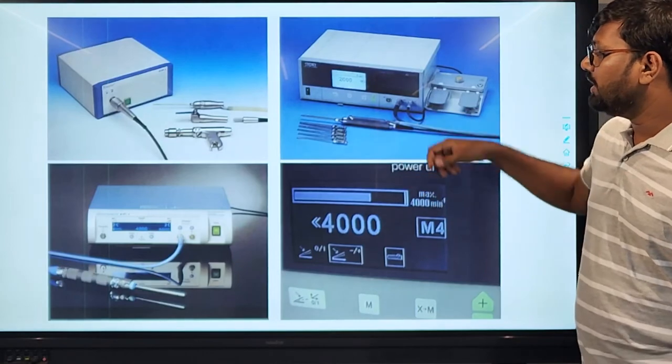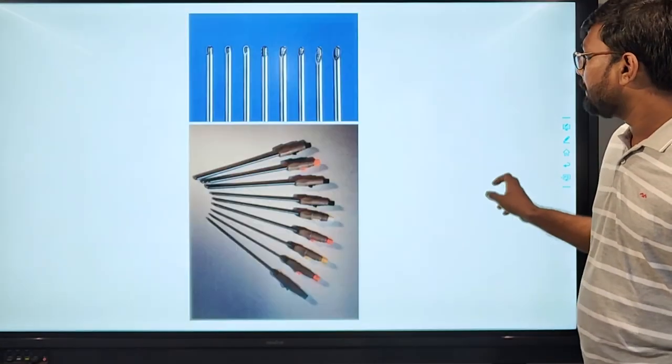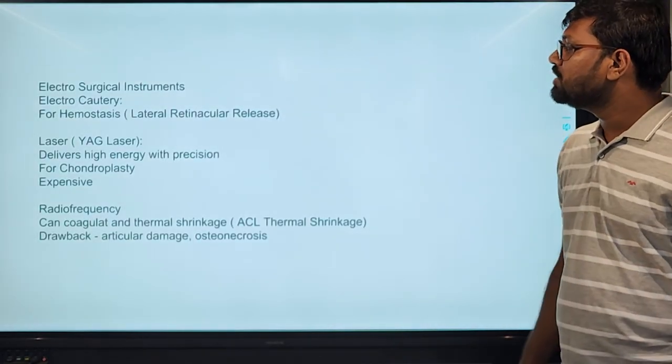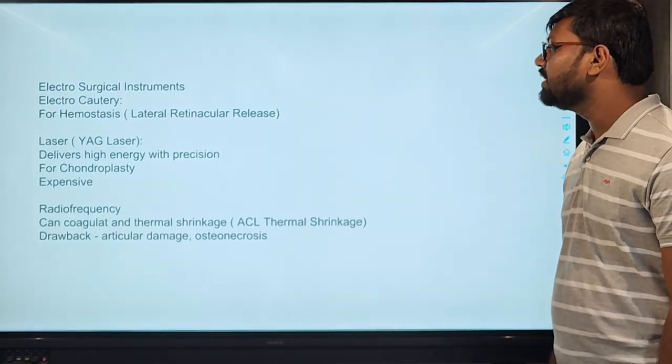These are the various shaver units, shaver tips. The electrosurgical instrument, electrocautery, mostly used in shoulder surgeries.